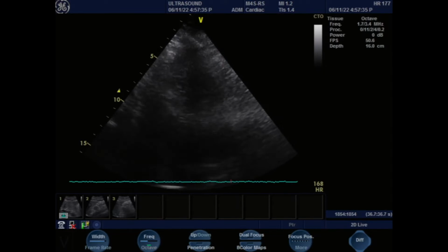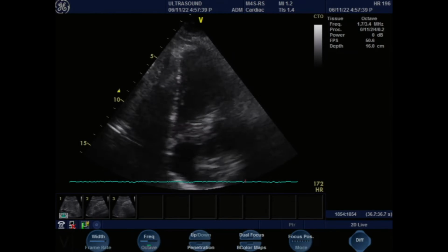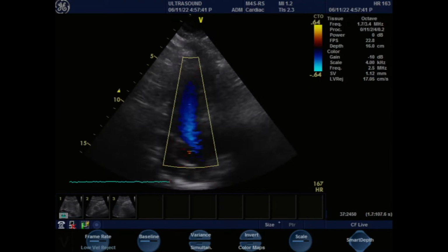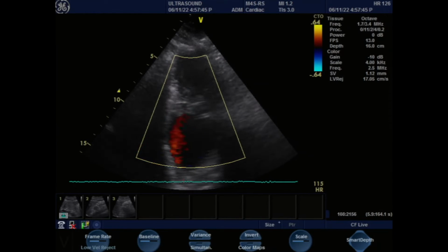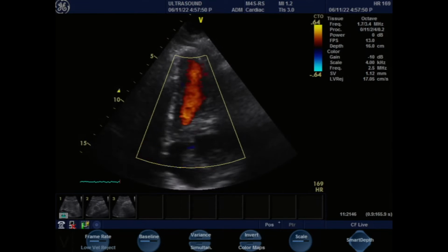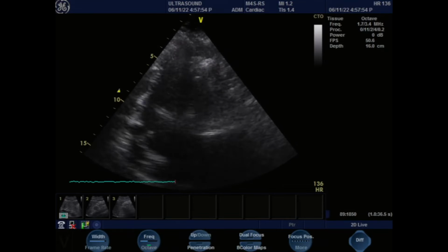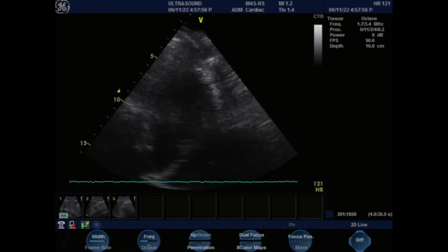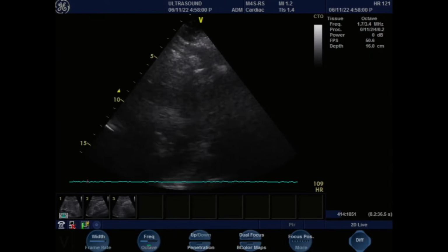All right, so what we have here, again, from this angle, but earlier, because he was sitting this way, the heart was not quite coming into the picture. But now that he's moved this way, the heart is dropping a little bit, and now we're able to get a perpendicular axis of the view. So what we're doing over here is we're just looking at his chamber. And let me see if I can get a little more depth.